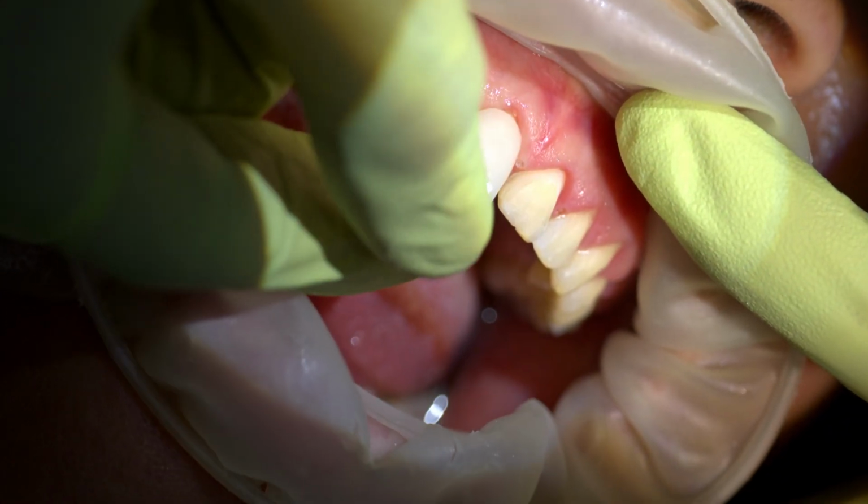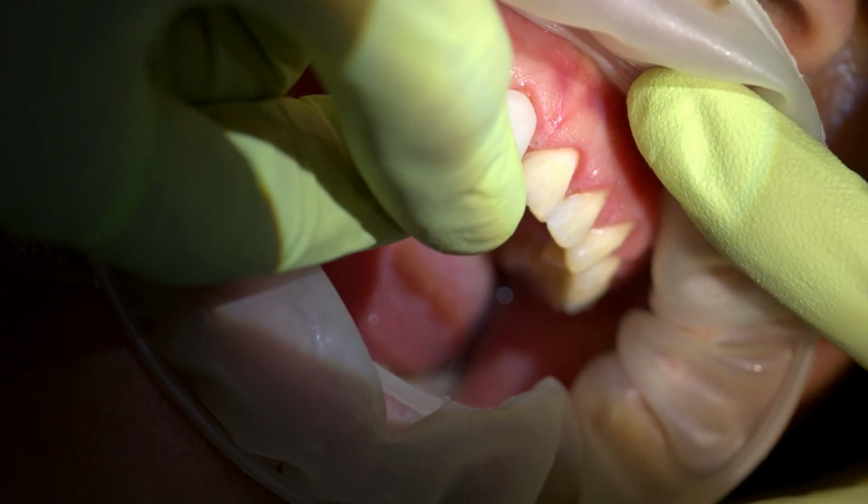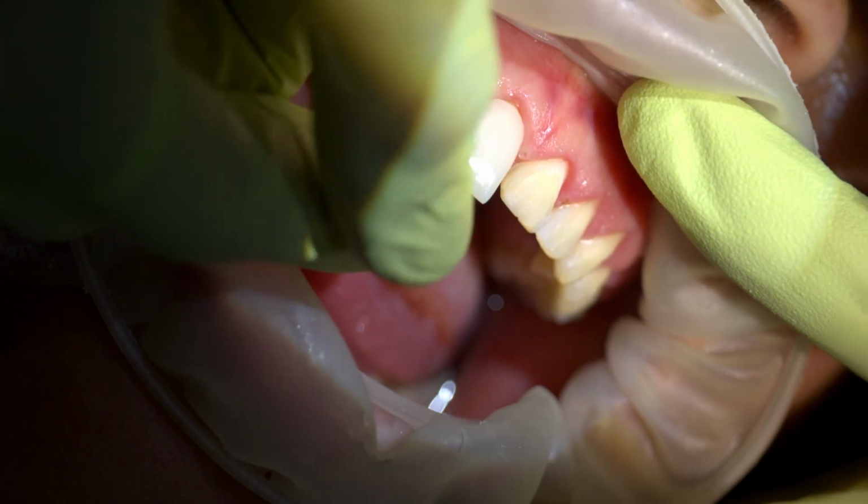Why? Because the light is different at the lab. When you're trying to give images, the camera's got to be perfect, and it's just a very difficult thing to do. Some dentists will even say, if you have a single tooth that's broken, you need to do the one next to it just to match it. And sometimes that can be good if you need it, but if you don't need it, why do more work than necessary? So with the in-house laboratory, we can bring the implant crown or the crown into the actual operatory.